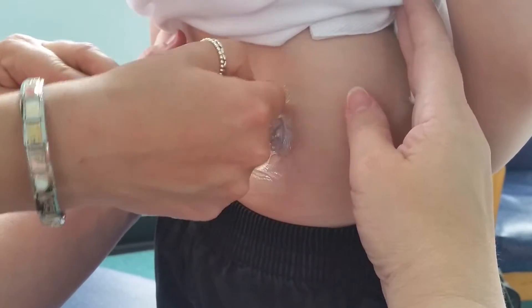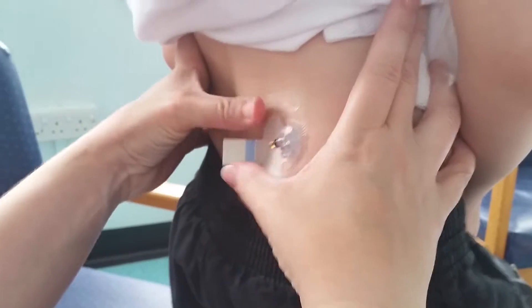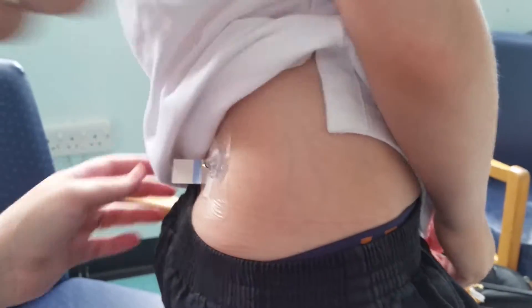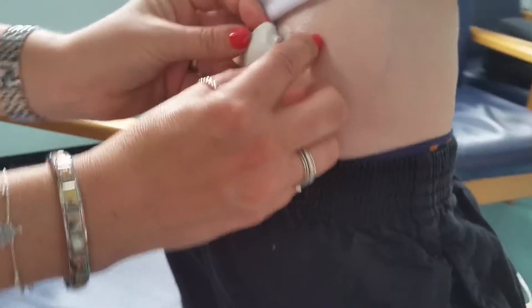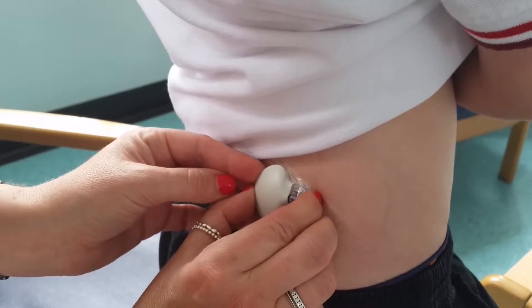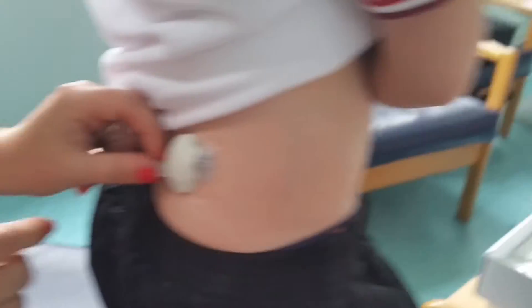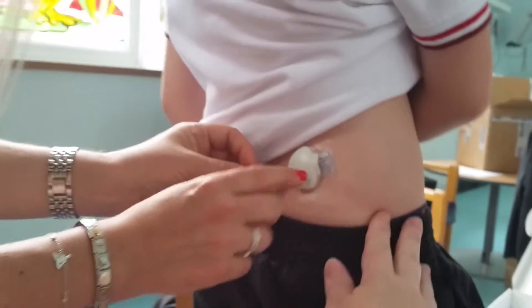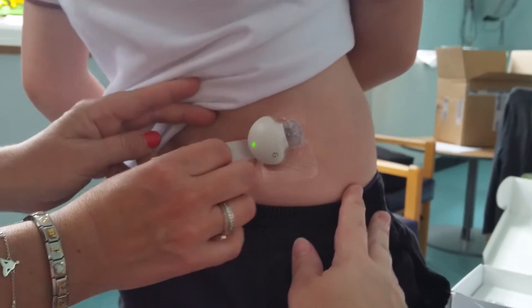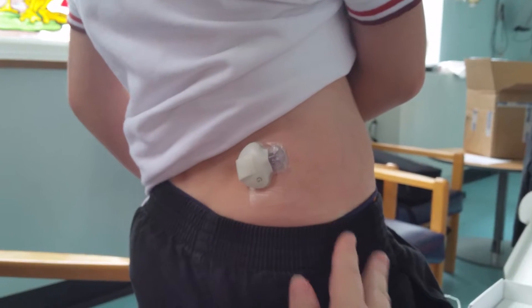At which point we grab your little disc — your little rounding — and that will click. I'm supporting this as it clicks. We're looking for a green light. Green light! We're just folding that over — we're not pulling or making it tight.